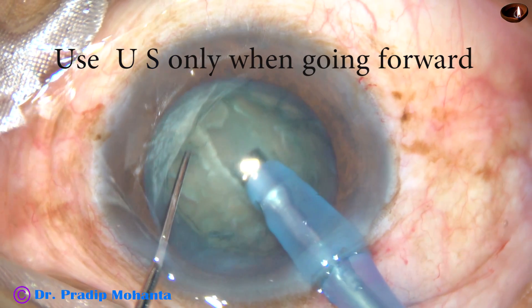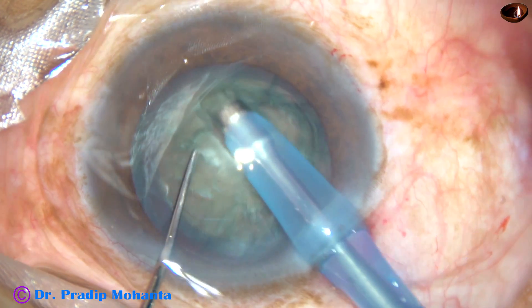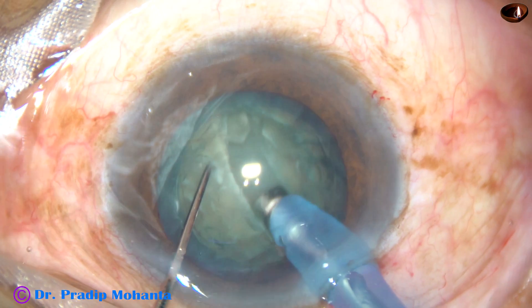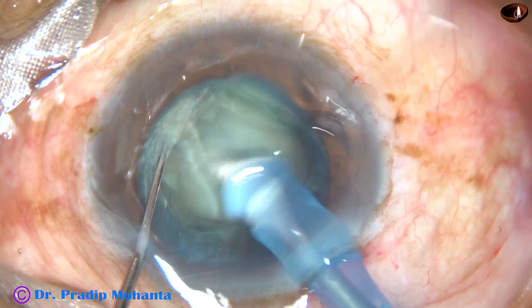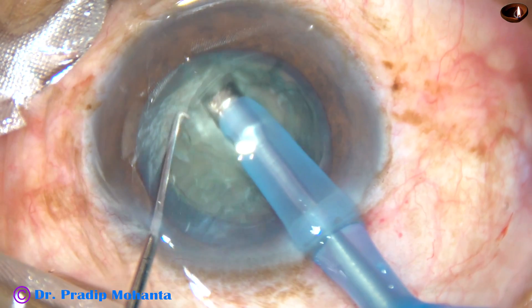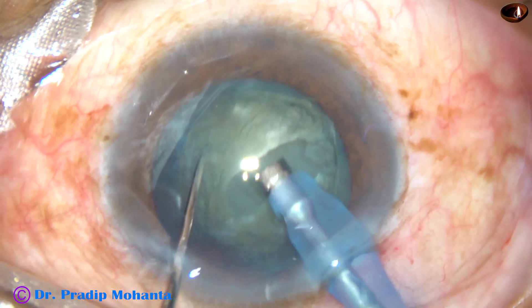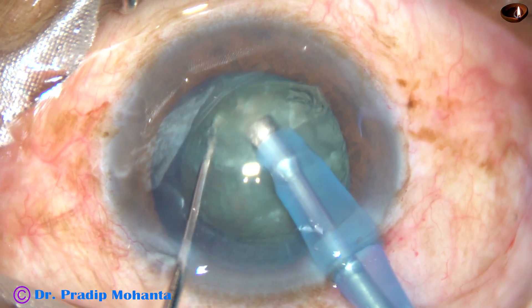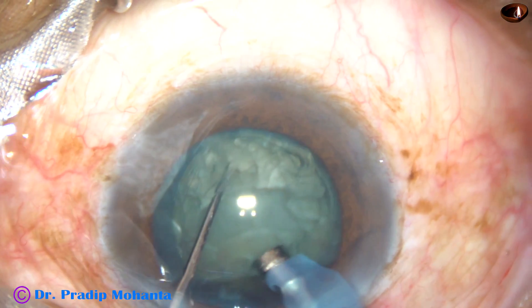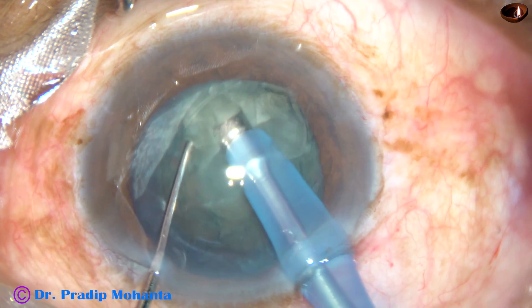But in this case, it was not straight. Always use ultrasonic energy when you are going forward. When you are coming backwards, stop using ultrasonic energy. Be in continuous irrigation so that if you remove your foot switch, the chamber is maintained. When you are making the trenches, the vacuum is very low, say 50 to 60 millimeters of mercury.